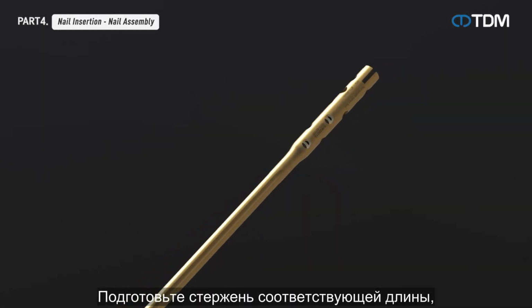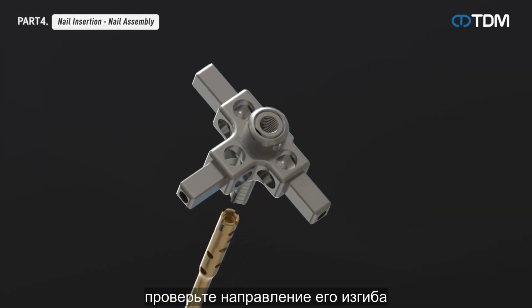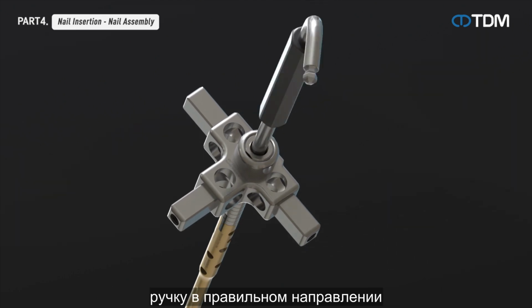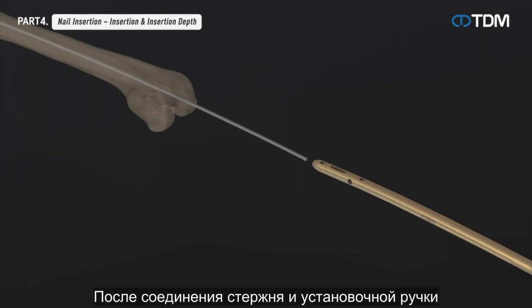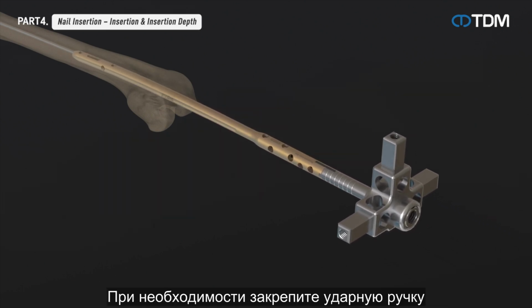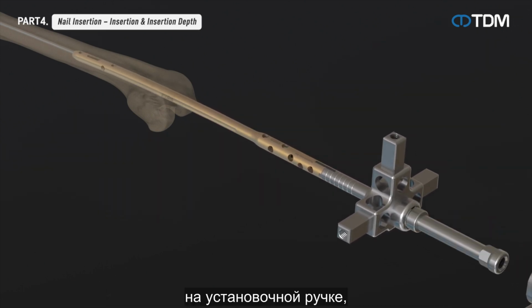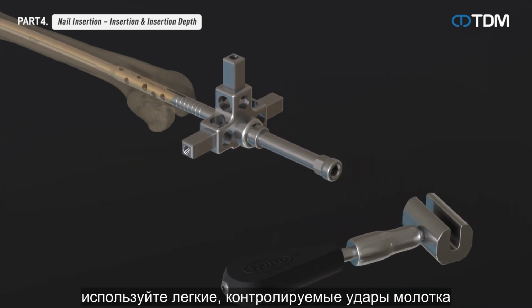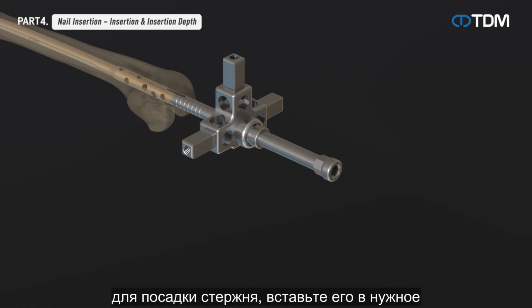Prepare a nail of appropriate length, check the bending direction of the nail, and combine the nail and the assembly handle in the correct direction with an assembly bolt. When the nail and assemble handle are combined, insert the nail along the reaming rod. Attach the impact handle to the assemble handle as necessary. Use light, controlled hammer blows to seat the nail. Insert it into the desired position and finish.